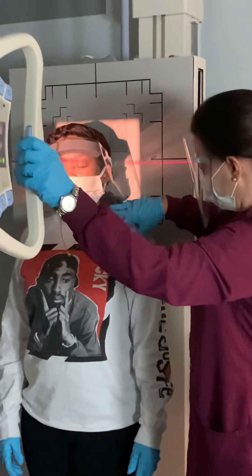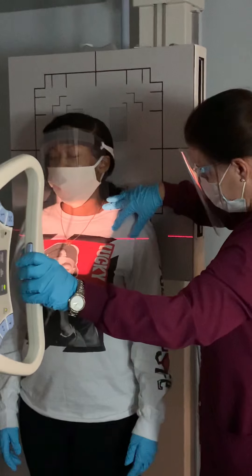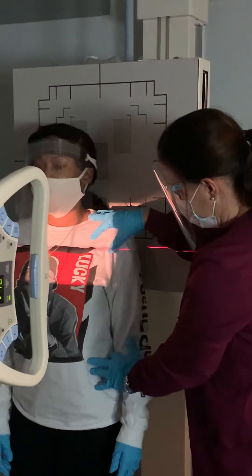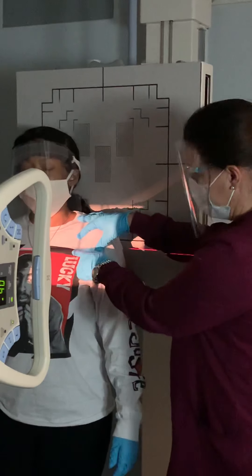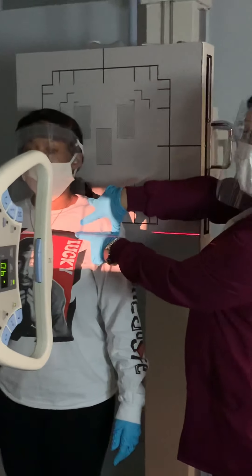So once I find it — close your eyes, don't blind your patient like I just did — come in one inch below, and I'm going to step you over to your right. My central ray needs to be one inch below the coracoid.